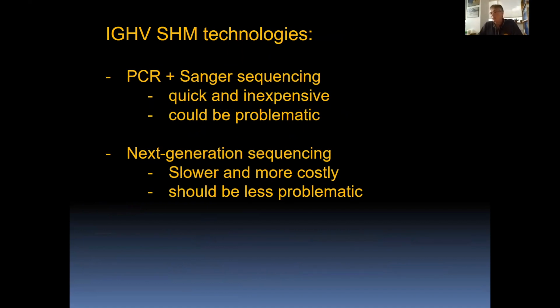There are presently two techniques. One is the older, still the gold standard, the Sanger sequencing, and since a few years, next generation sequencing is beginning to take over the analysis method because it has certain attractive characteristics that make it better suited for this sort of analysis.